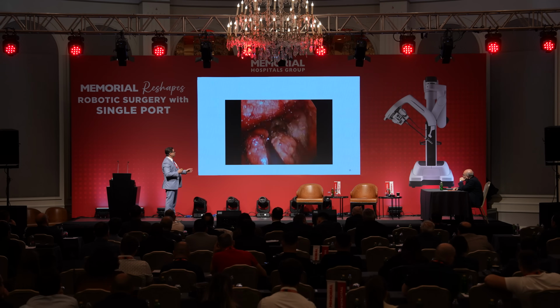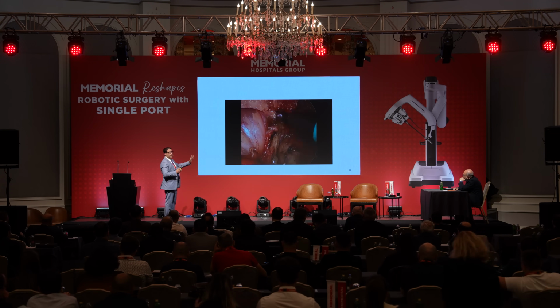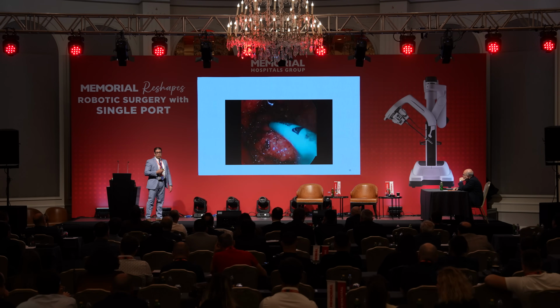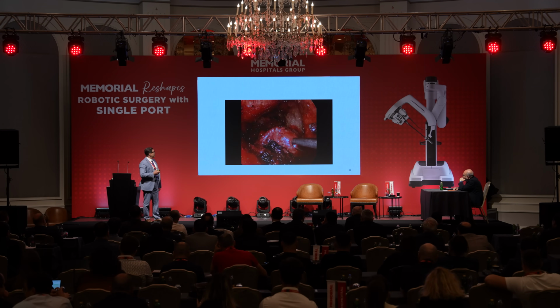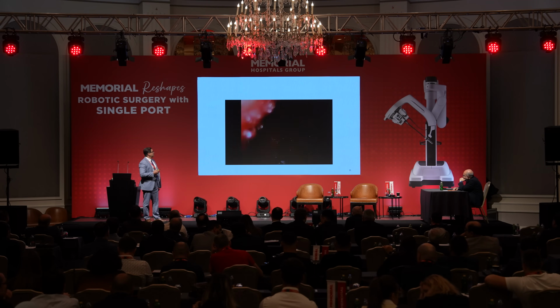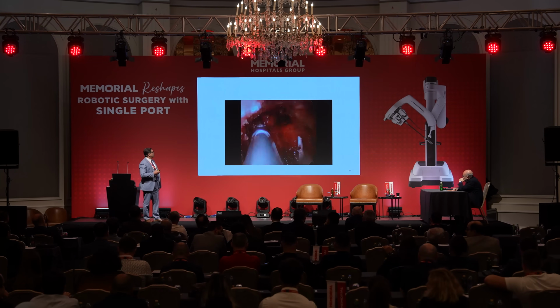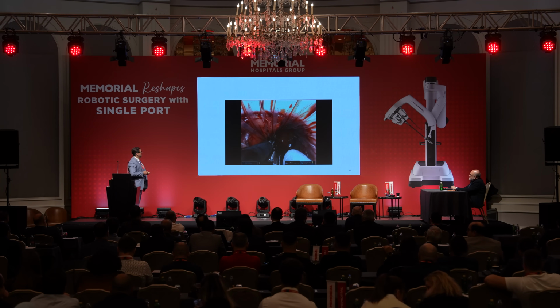Now you can see I'm going to push. I'm finishing the right side of the peritoneal reflection, and the whole rectum now is going to be pushed into the abdomen. So it is doable. It is, and it saves a lot. And then here you go. You can see I'm at the sacral promontory there. So I'm going to go to the next one.